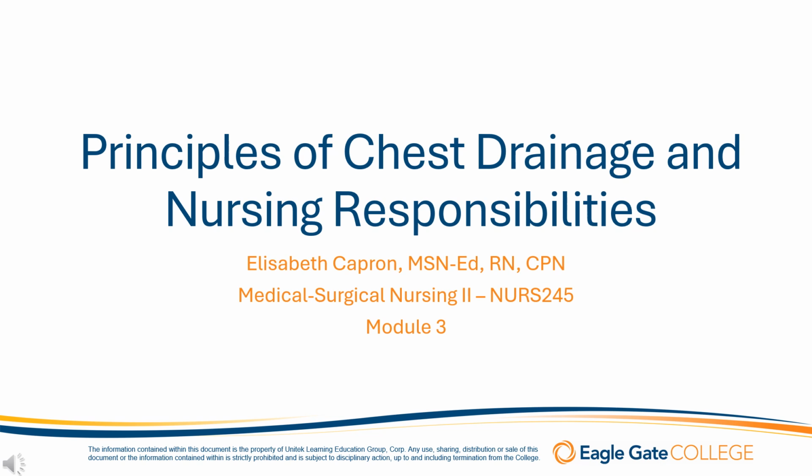We talked about the classic systems, but there's also this special one-way valve, the flutter valve. Oh, yeah, flutter valves. Those are really cool. They're great for certain kinds of pneumothorax, especially for patients who aren't in the hospital. So how do they work? How are they different from the other systems we've been talking about?